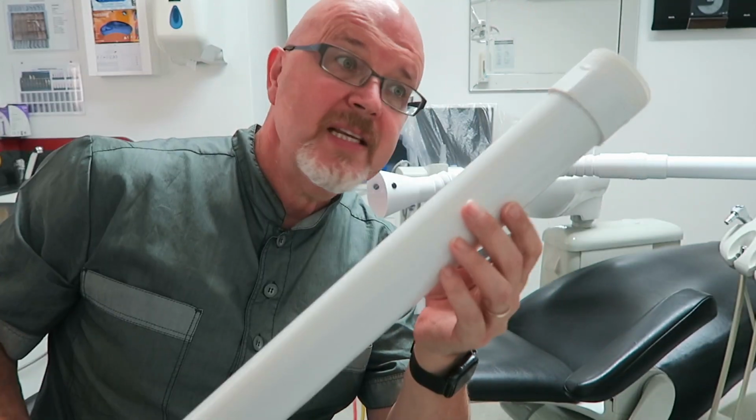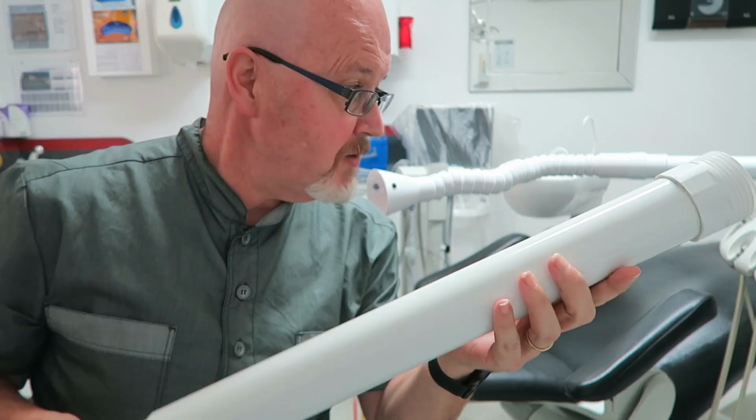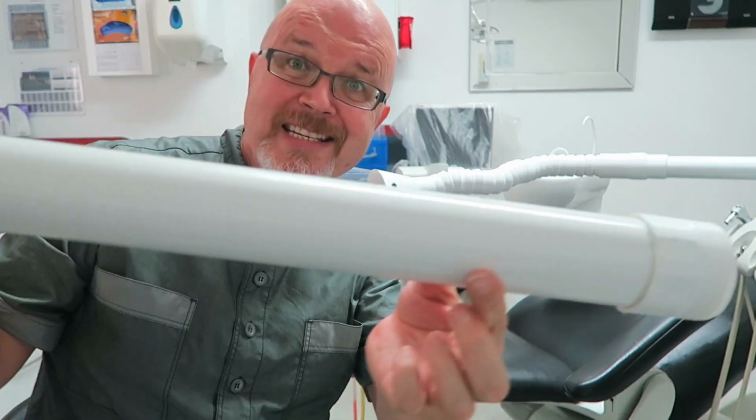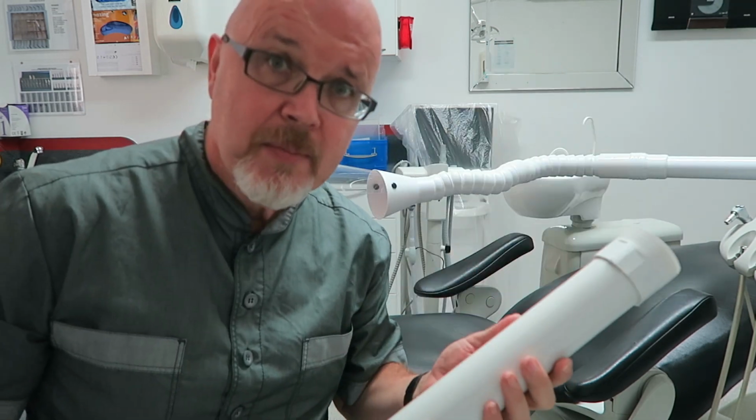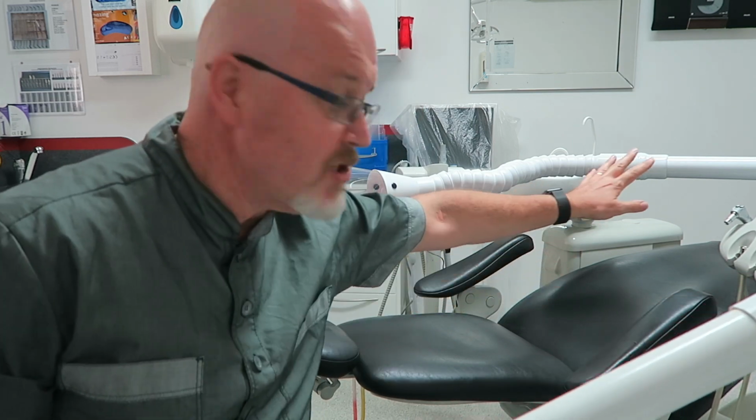Hopefully just a quick one, bit of an update. I have received just recently this arm. Now, this is from Vodex UK. Apparently this is the very first one in the world. It is a prototype model, but having spoken to them in relation to the issue of putting this at the bottom of the chair, they've come up with this, and this apparently is going to be developed and will be a production add-on to the DentalAir.